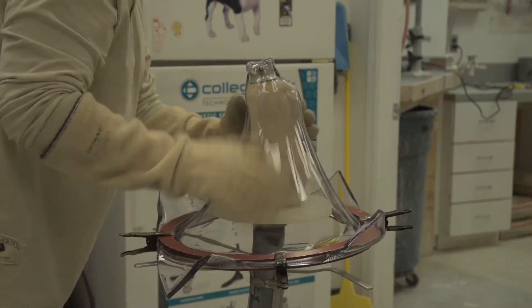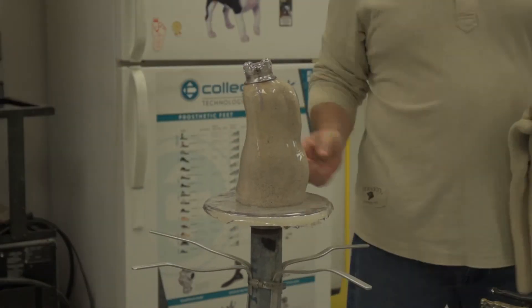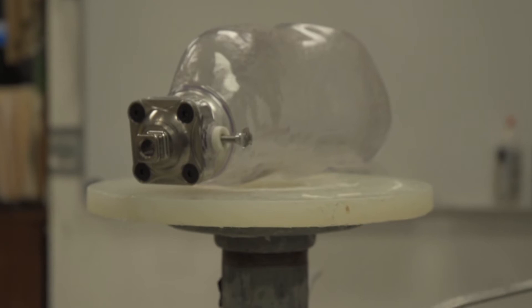Then we go from there to pulling some plastic over it and vacuum forming it to make a test socket — something I can see through to make sure that nothing's rubbing or bumping. I'll have the patient walk in it a little bit just to check it out, make sure everything's all good. If that works out, I take that test socket, fill it with plaster, and then do a final lamination.